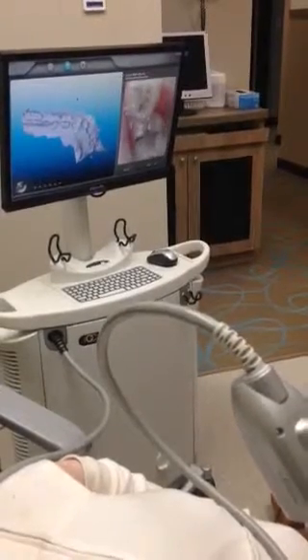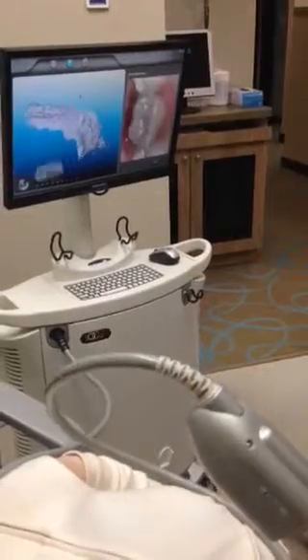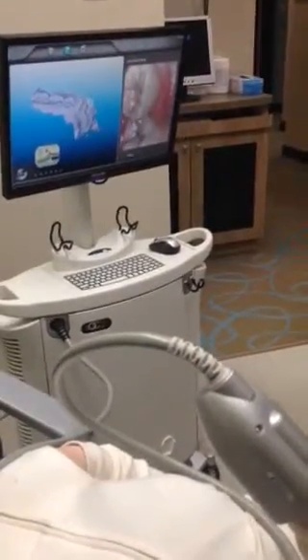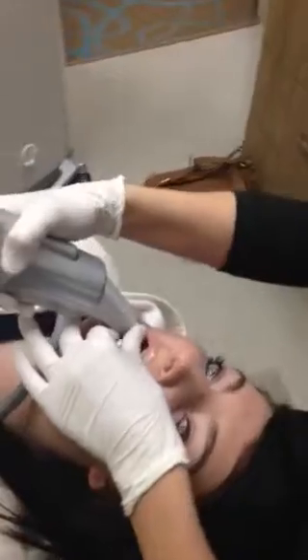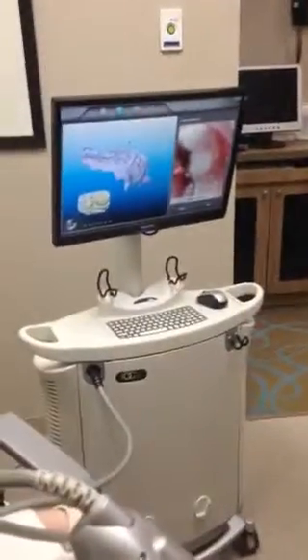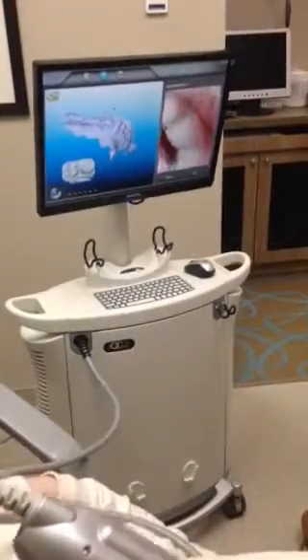So then, same thing on the other side. And how long does it take to usually do the upper and lower impression? It usually takes about 7 to 8 minutes. So it will say, please retake scan if it doesn't like the scan or if you're moving too much. It's pretty smart.